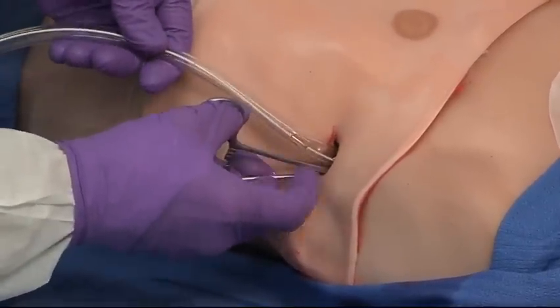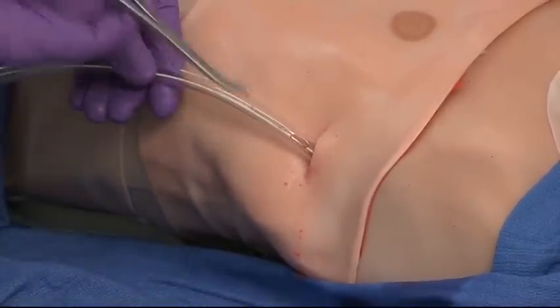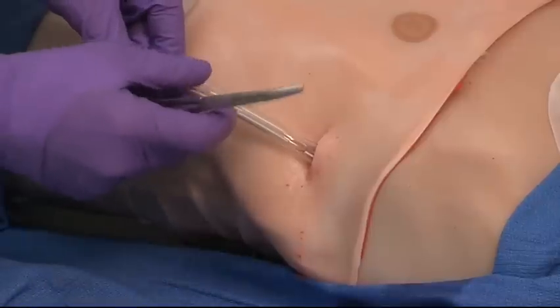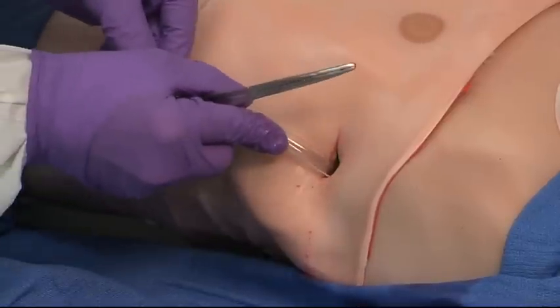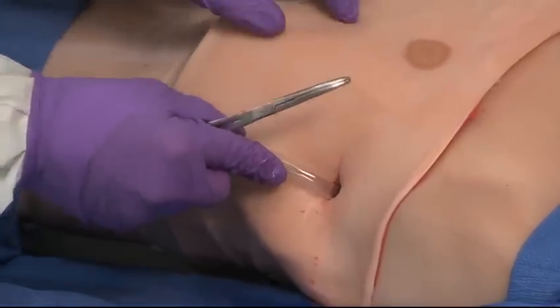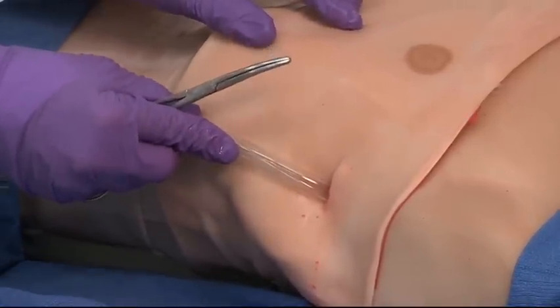You can see I'm going into the chest. There's the last hole. My goal now is to have this go in a posterior direction, laying along the back of the chest wall towards the apex. So that last hole's going into the chest, I'm advancing it, and I usually advance this till I feel a little bit of resistance. That tells me I'm bouncing off the apex, and then I pull back a slight amount, so this is 1 or 2 centimeters from the apex.